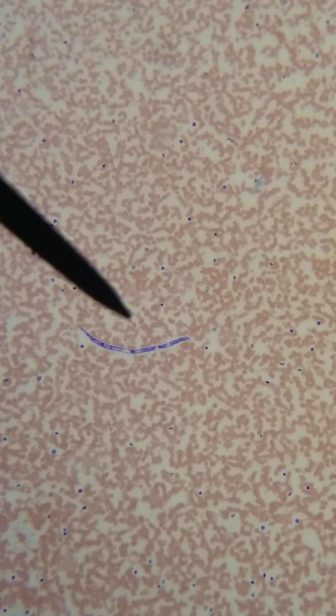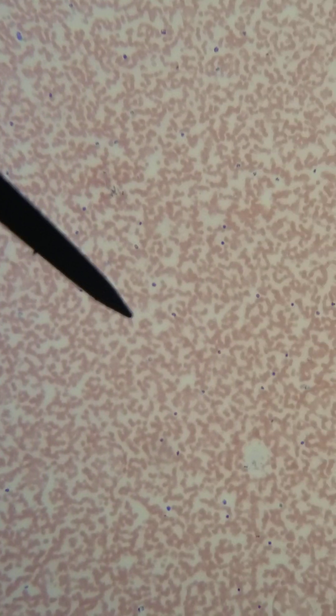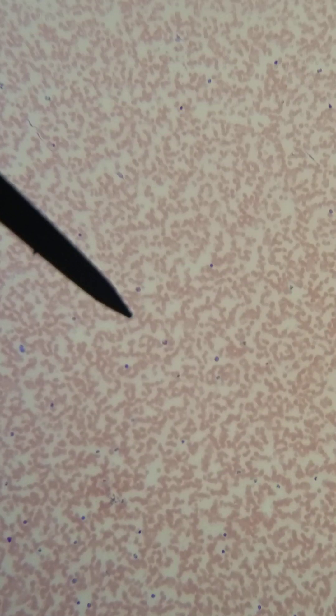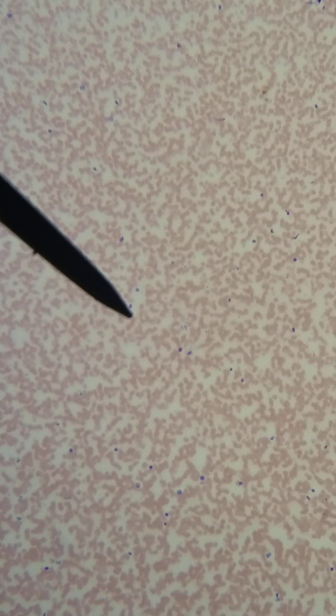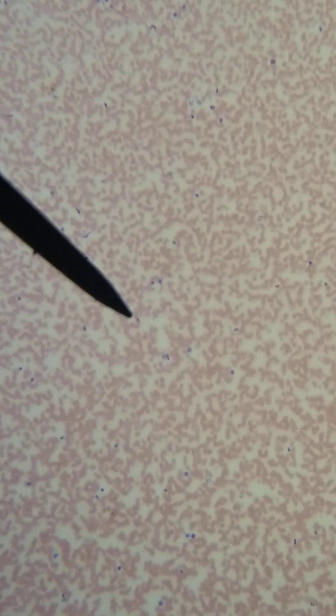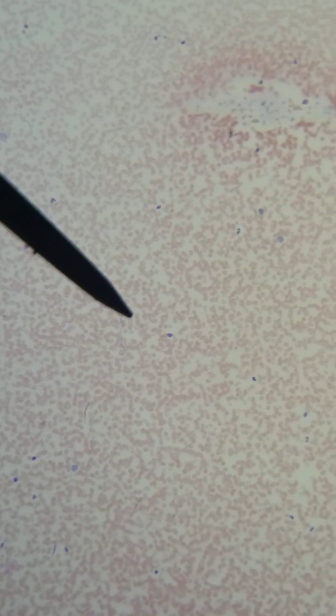This is a Giemsa stain. So just as if you were looking on a peripheral blood smear, this is part of your scanning — your 10x scanning. If you don't go to that thick area, you may not see a microfilarial worm. This is a really great reason why you should go around.